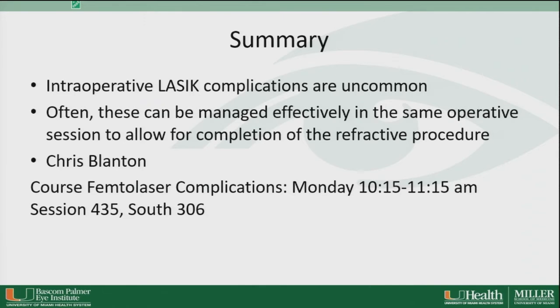So in summary, intraoperative LASIK complications are uncommon, and often these can be managed effectively in the same operative session to allow for completion of the refractive procedure.